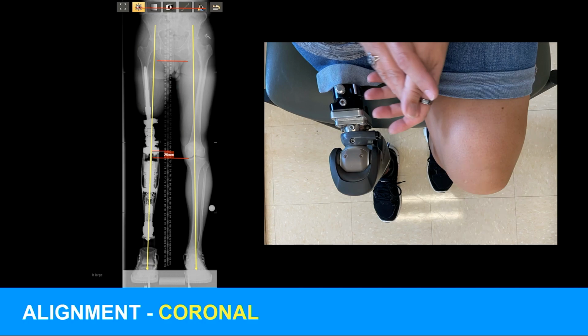One of the other benefits is repeatability in donning. How much time have we spent trying to teach patients how to don an above-knee prosthesis properly? That's now not important.